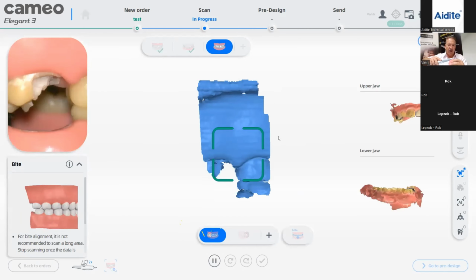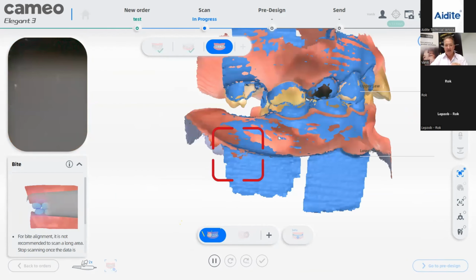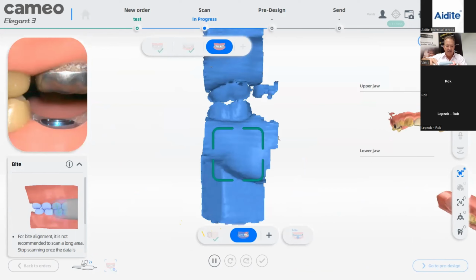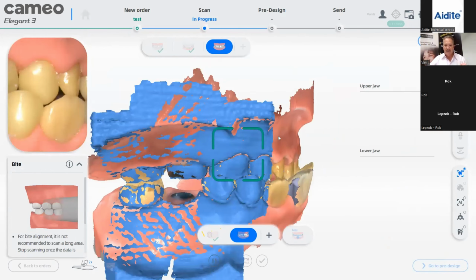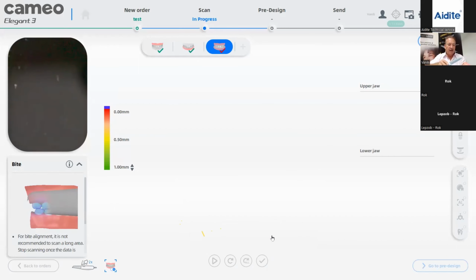just go to the model and go up and down. And you see it's already selected it. Then put the camera down or press the button, go to the other side, do the same thing. You have to go up and down to get the information, and do it like that. Now we have the last picture. You see here, this will be the central. Third bite. We do third bite. So basically you go here and you do it in front.